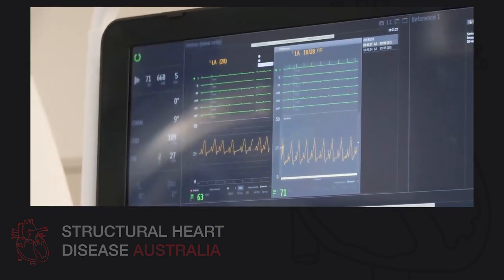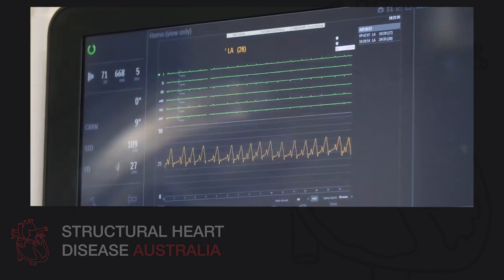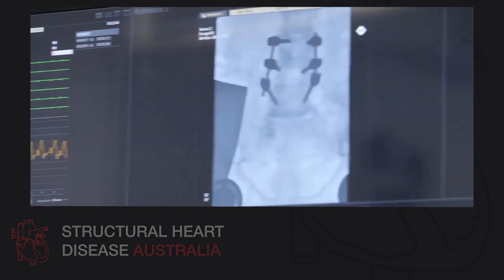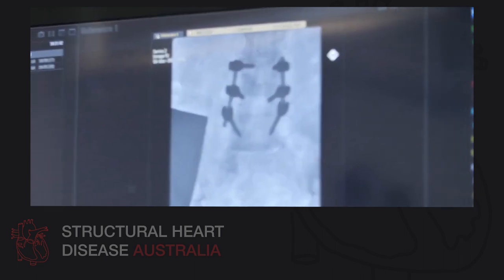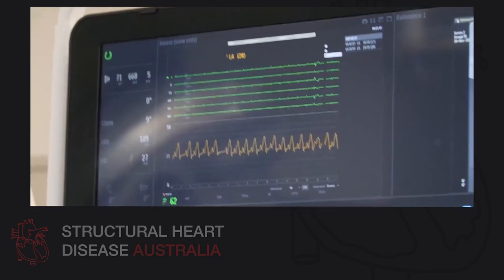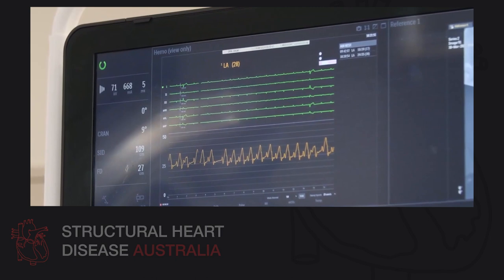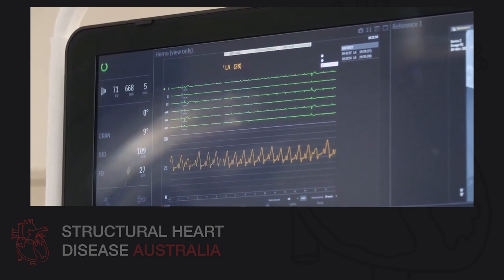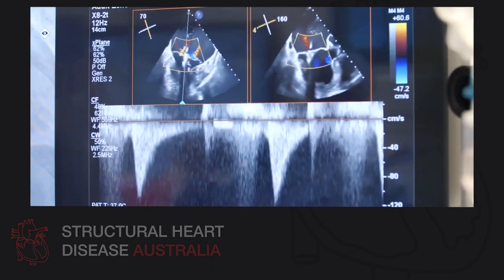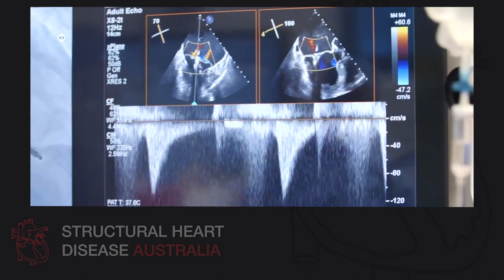Assessment of mitral regurgitation after clip implantation, often you bisect the jet, causing two separate jets at the point of grasp. And this actually can increase the total area of the color. That's an iatrogenic effect of grasping the leaflets and bisecting the jet. But this does not necessarily mean that the MR has gotten worse. It does affect the color assessment of the MR. That's why we look at other objective methods like left atrial pressure measurement, and we can see there was a clear reduction in the left atrial V wave.